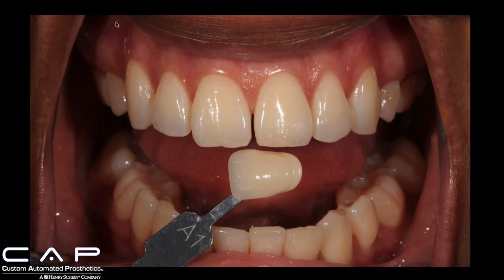Now, one thing that I learned several years ago from a friend of mine and very talented technician, Thomas Singh, is that you should hold your shade tab at this horizontal position. And there's two reasons for that. One is when you're holding up a shade tab in the mouth, you have a long way to go between the actual shade tab and the shade marking itself, the identification of what you're using.